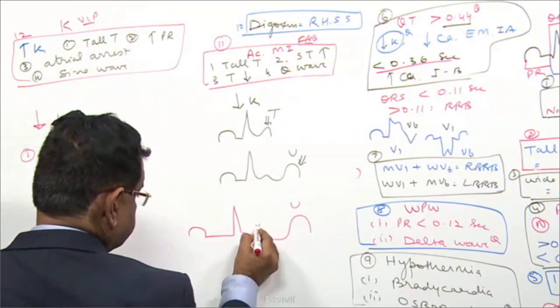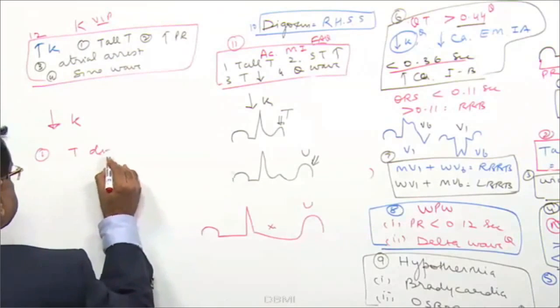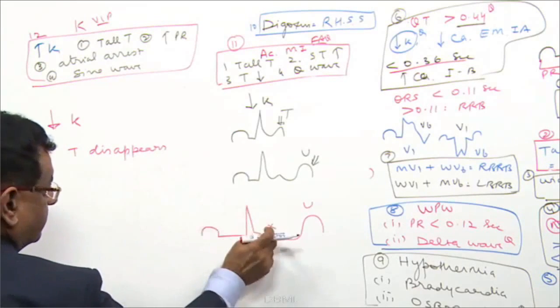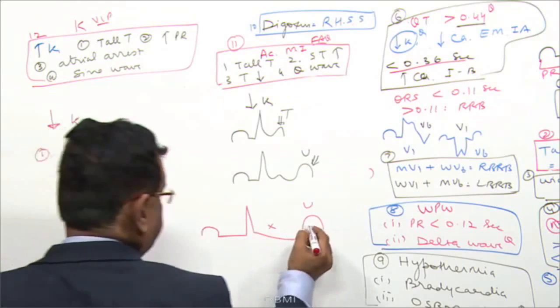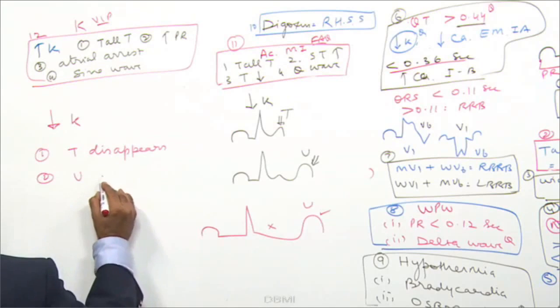Look, T has disappeared. And a prominent U wave has appeared.